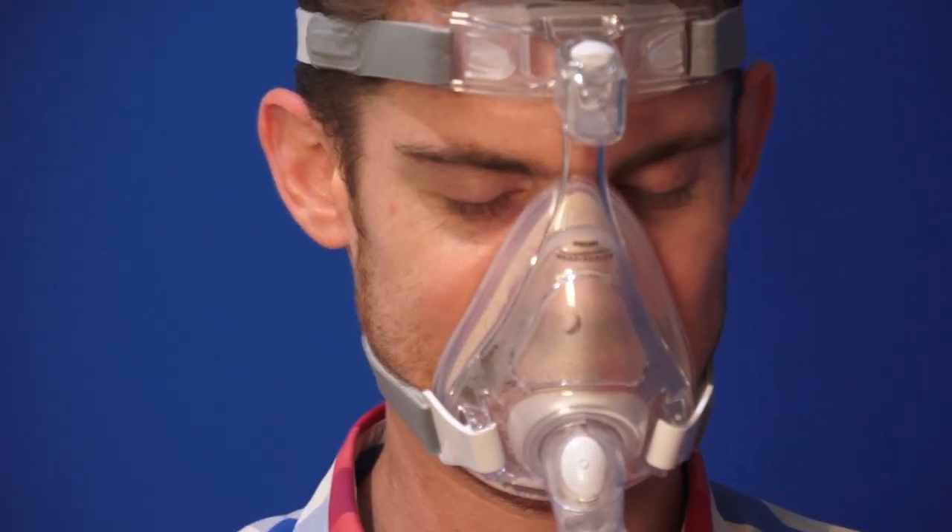I used the lighter version because my apnea was not that severe. When I put it on my face and tightened the straps, I was sleeping like a baby. You really don't feel like you have the device on you. It's very comfortable because the plastic is very soft — it's silicone-like. About five minutes into it, you won't even know that you have it on. The device was simple to use and I got a great night's sleep.